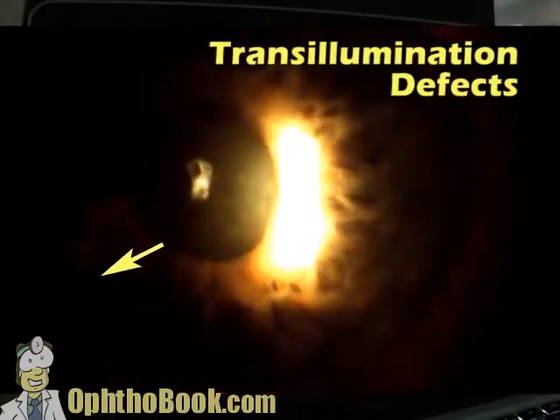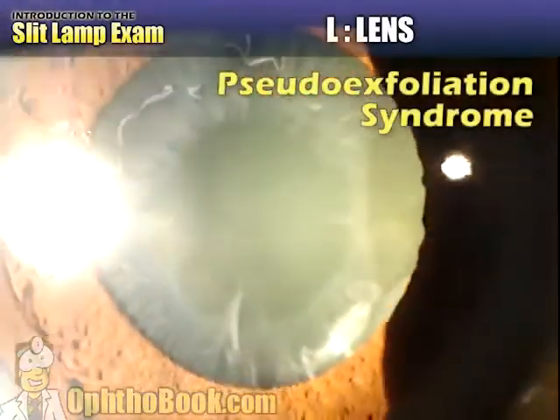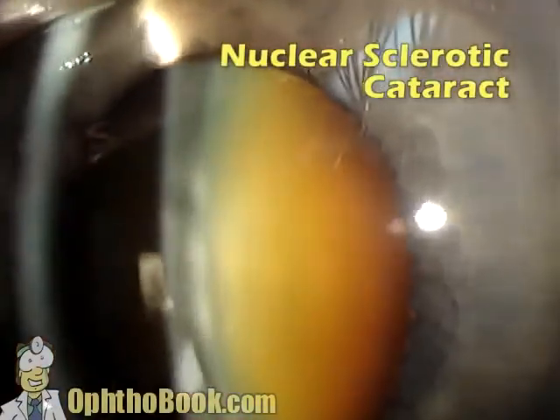You see it with pigment dispersion syndrome. You can also see something very similar to this with pseudoexfoliation, where you have this dandruff-like material that forms on the surface of the lens, and as the iris constricts and dilates, it rubs off that pigment, and you can see these findings. Our standard cataract, a 3 to 4 plus, nuclear sclerotic, very yellow, very brunescent.